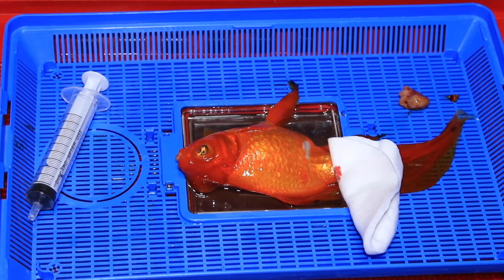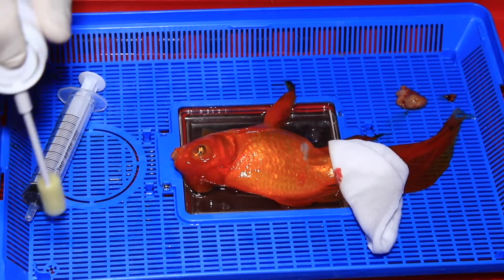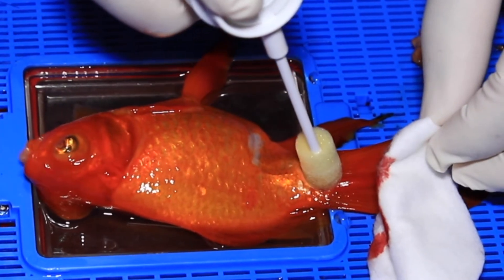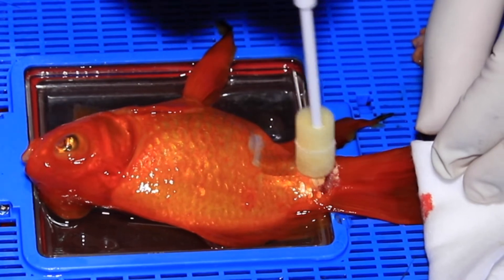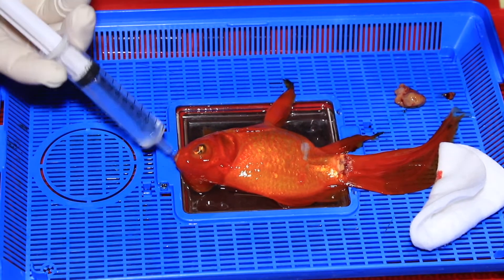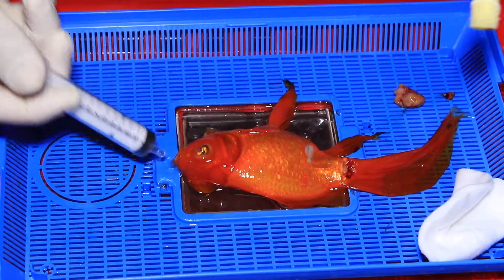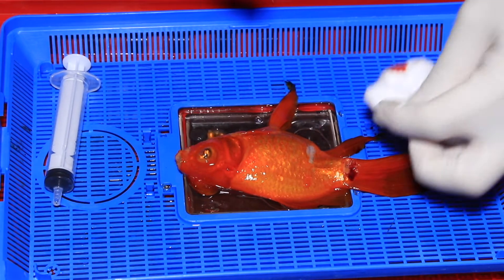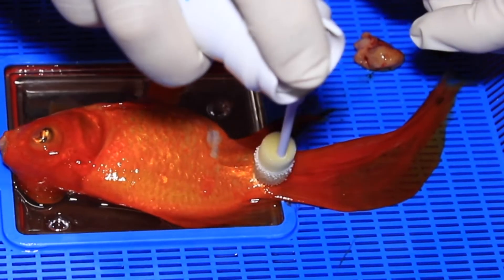Next we're going to apply cryosurgery to the site because the scalpel blade cannot reach the deeper parts of the tumour, and we want to kill off the roots. How this works is that it freezes all the soft tissues that contain a lot of fluid and water, creating ice crystals within the cells. The ice crystals cause damage to the tumour cells by breaking through cell membranes as the crystals form and thaw. It's not specific to the tumour — it affects all the soft tissues around there. We have to get rid of all traces of tumour tissue so it does not grow back.